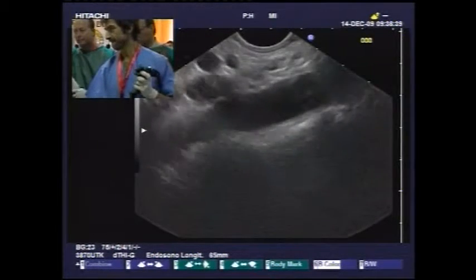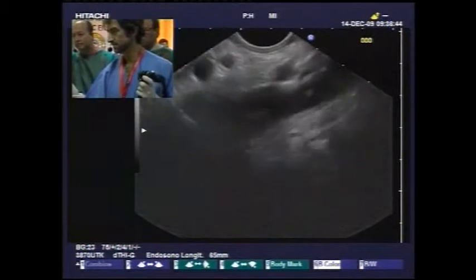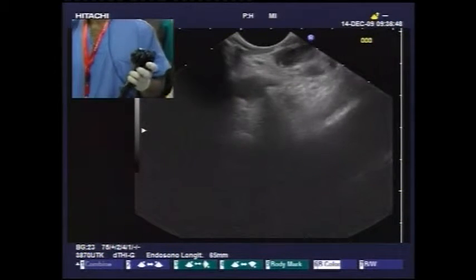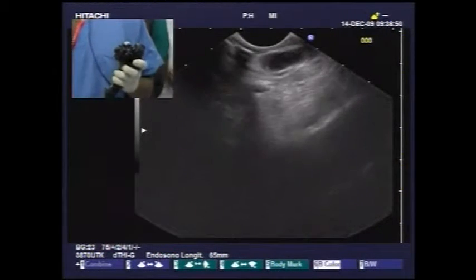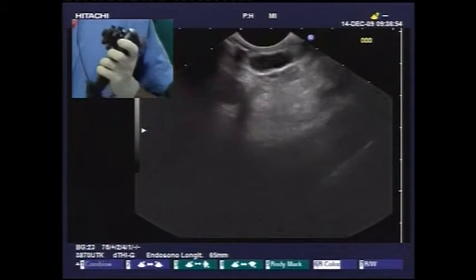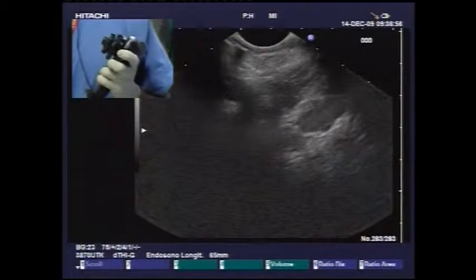We'll put in a nasocystic tube. That helps with flushing and things like that, isn't it? We'll put the wire in place. Wire in place. Can you see this now? So I'm going to now change to a cystotome. Push the wire. I'll take it out. Is this okay? You are able to push? Resistance is there?